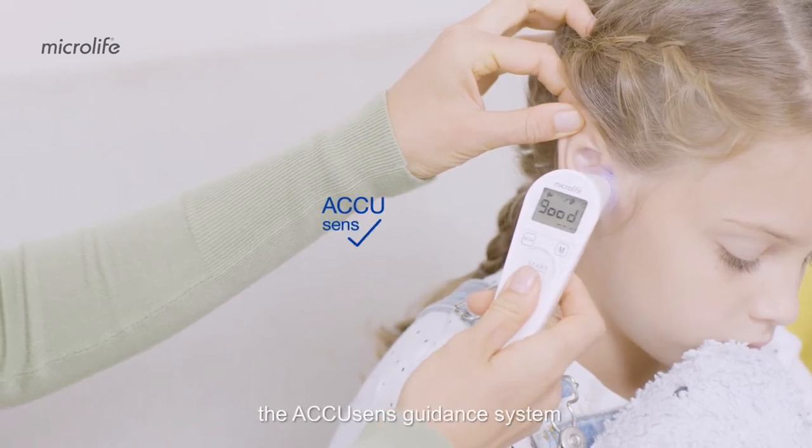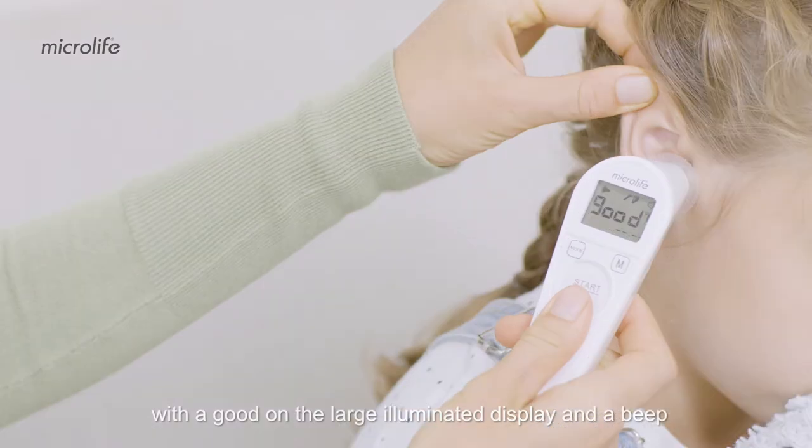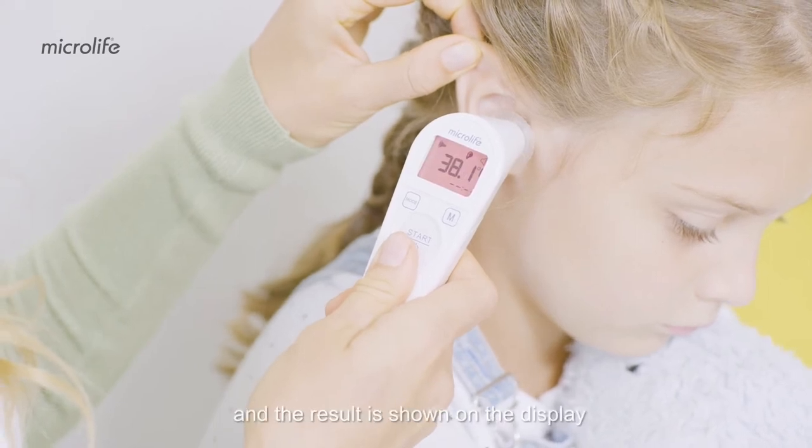The AcuSense guidance system confirms a secure position and accurate reading with a "good" on the large illuminated display and a beep. Press the start button. A long beep is heard and the result is shown on the display, even clearly visible in the dark.